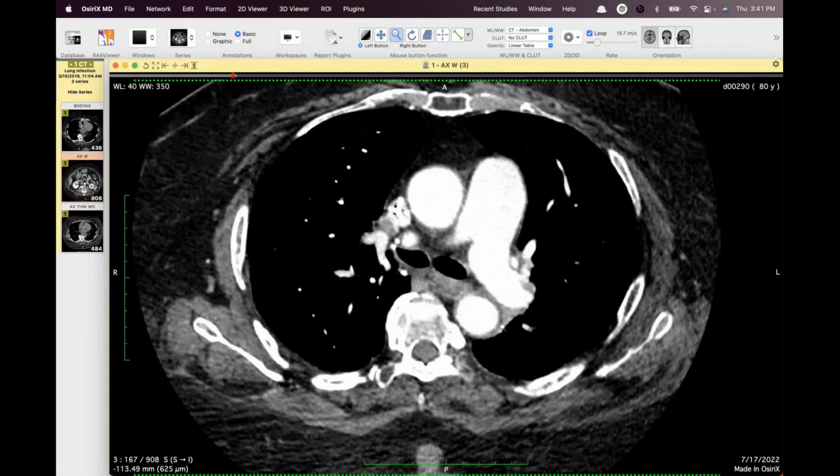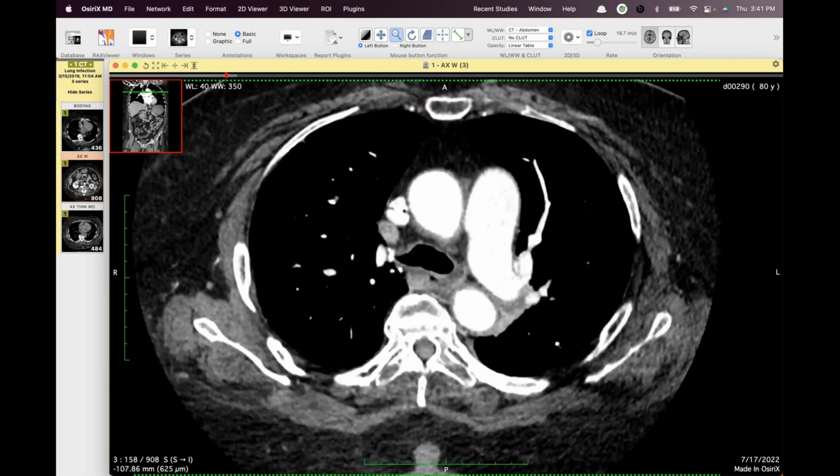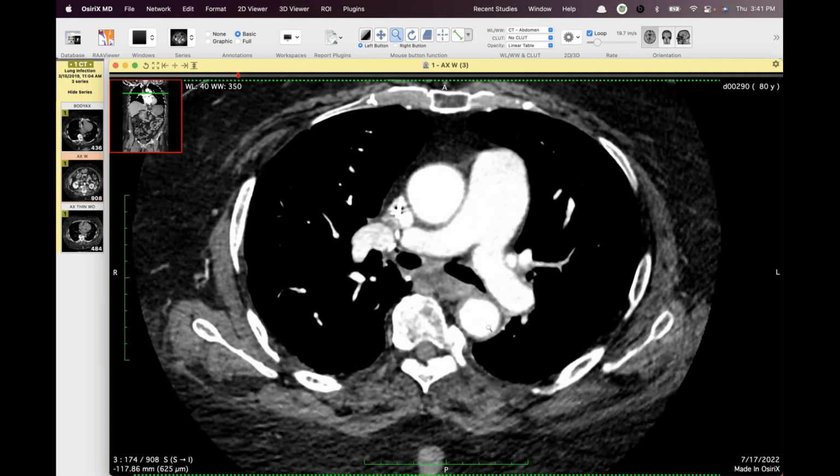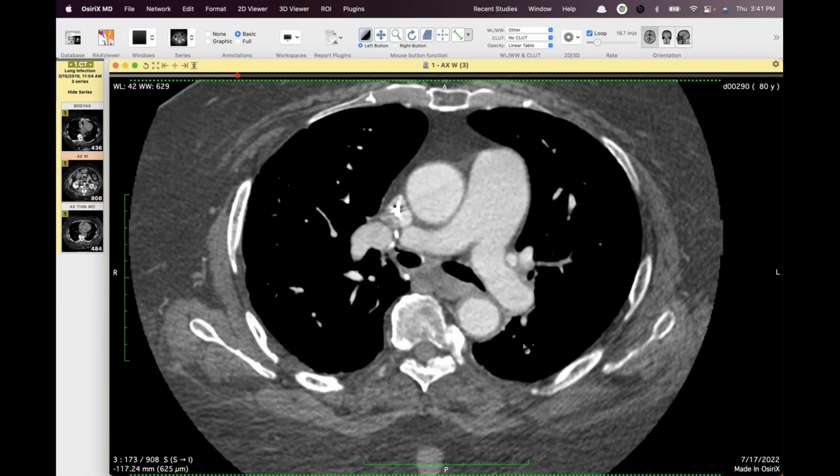But of course, this wasn't read in our division, and so one thing leads to another, and it's, this has got to be cancer, yada yada yada. They bronch the patient, biopsy these nodes. There's nothing, and there's one thing here that I noticed because I was reading a follow-up. I'll show you the other studies.